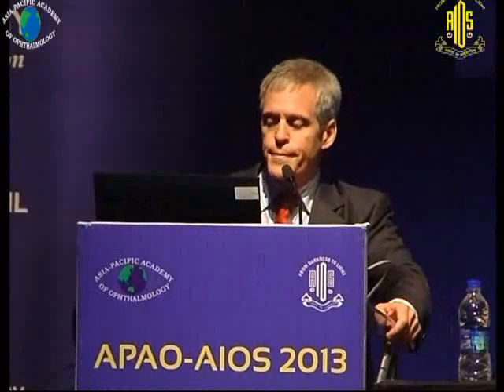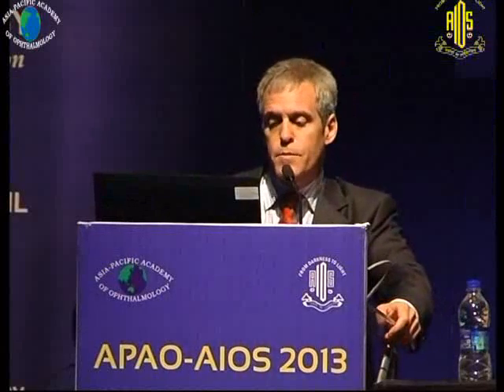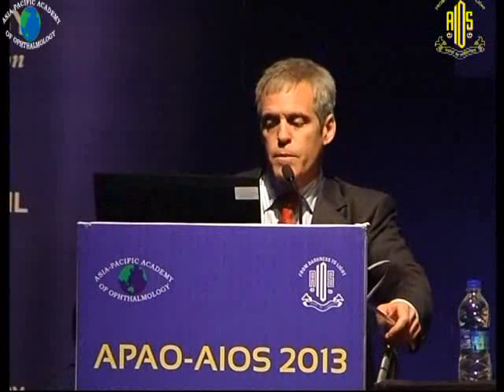Do we want to use a fragmatome? Do we want to use 25, 23 gauge? Do we need heavy liquid to float cataract or lens material forwards? And once we've done that, we want to assess the capsular support and we want to restore emmetropia. So if there's adequate capsular support, we may look at dialing the existing PCIOL, if it's only slightly subluxed, or putting a new PCIOL in the anterior capsule. Alternatively, if there's not adequate capsular support, then we look at those other options listed there.